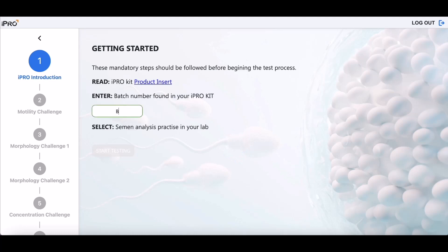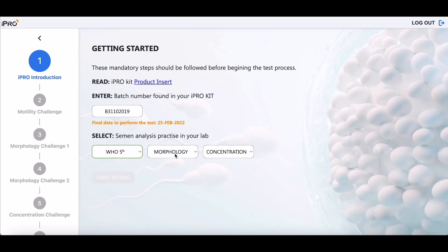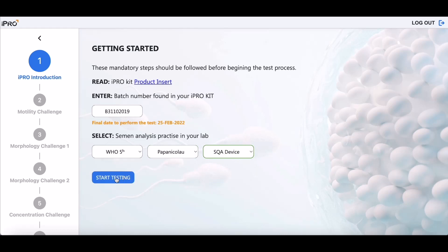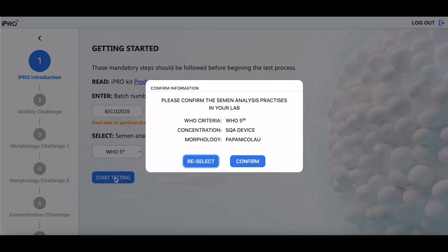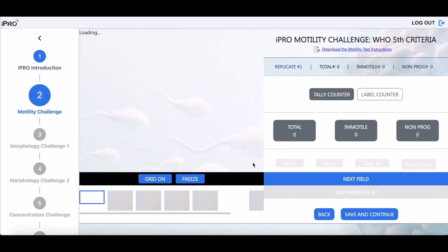Next, enter the batch number located on your iPRO test kit. The iPRO Challenge can be set up to follow the same WHO guidelines you use in your laboratory for testing sperm motility, concentration, and morphology. Specify the semen practices followed in your lab, then you are ready to begin.